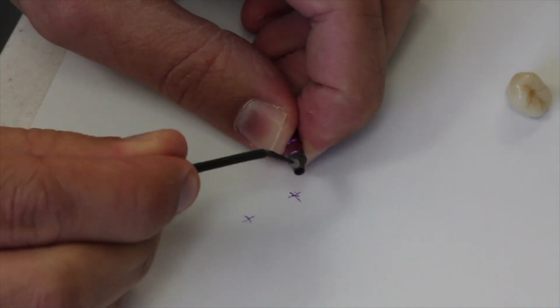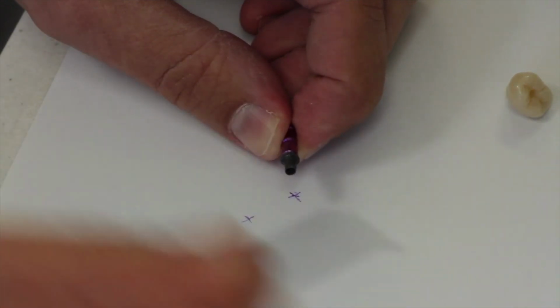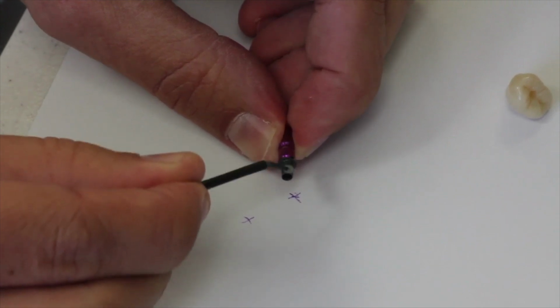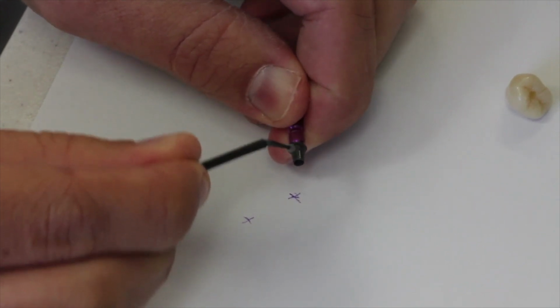After the titanium base has been sandblasted, the next step is to apply Monobond Plus to the titanium base. Monobond Plus has metal primers which will aid in the bonding of the Emax abutment to the titanium base using Multilink Hybrid Abutment.